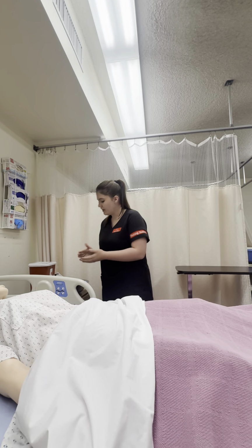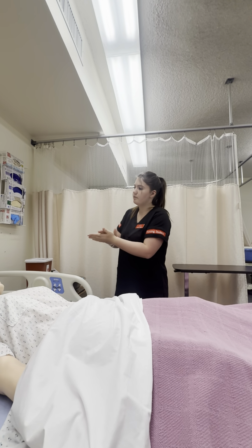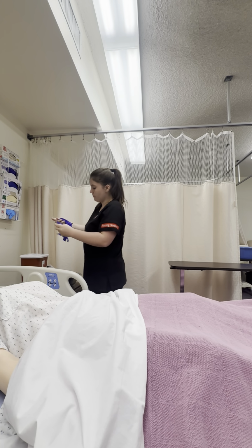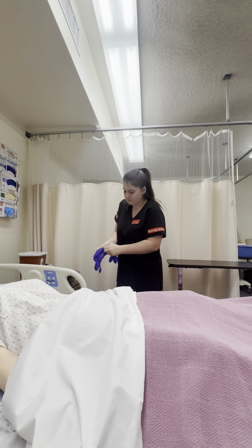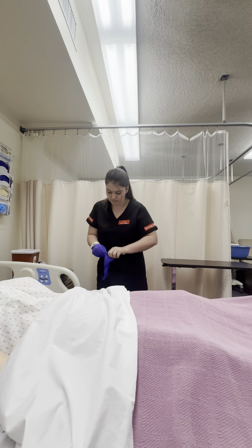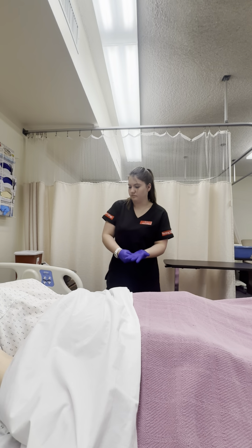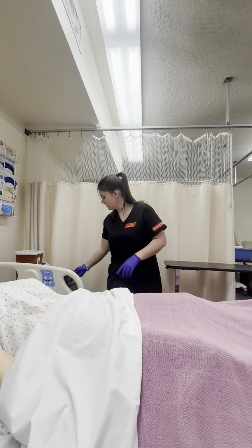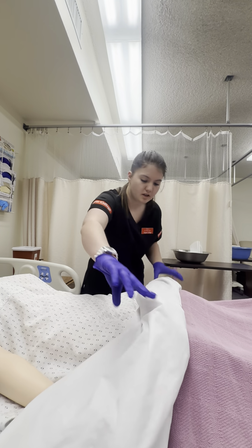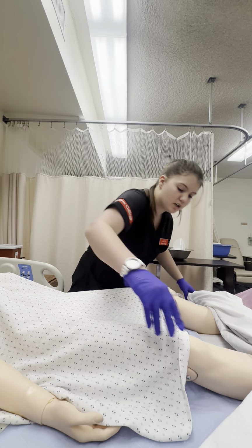All right, well, I'm going to go ahead and glove up. I'm going to do a quick abdominal assessment. I'm just going to make sure that your abdomen is looking and feeling okay before we get started. Is that okay? Okay. Okay, I'm going to go ahead and put on my gloves. And I'm going to go ahead and expose you. Is that okay as well? Okay. I'm going to place all of my supplies just over here on your bedside table, and I'll go ahead and expose you. Put down your gown. I'm going to put that all the way down just because we're going to be removing it.